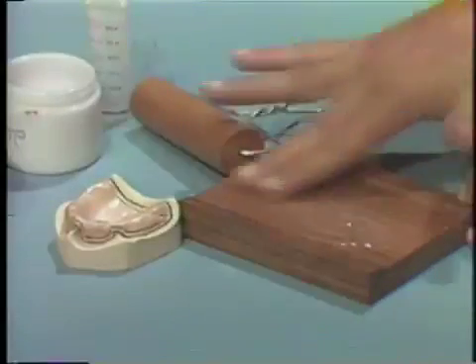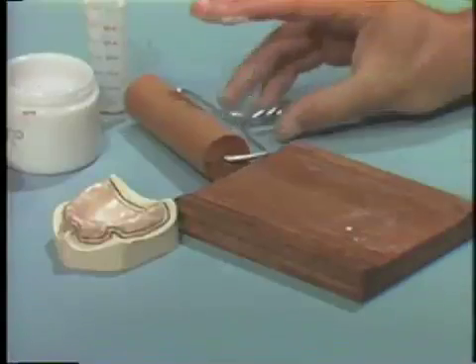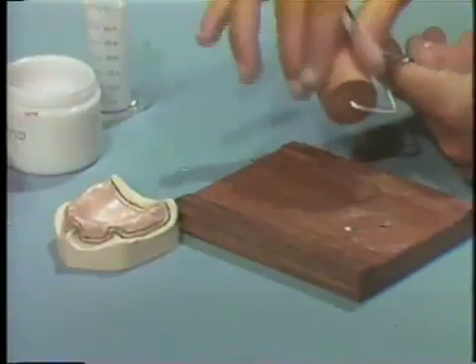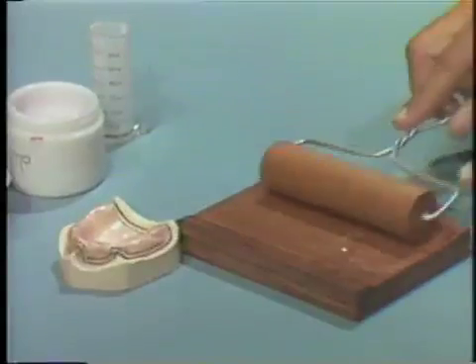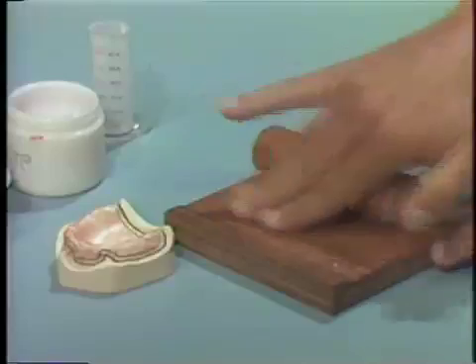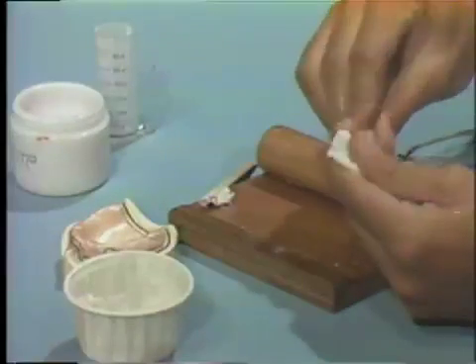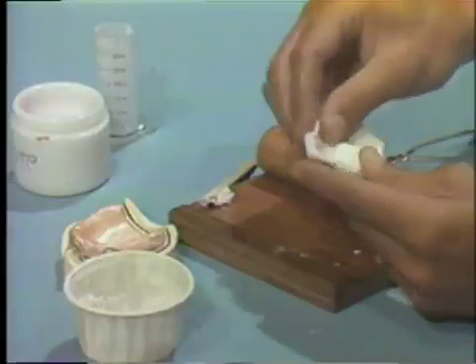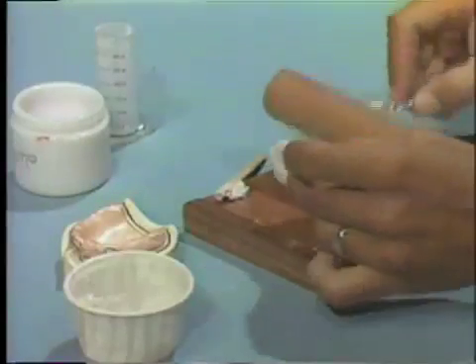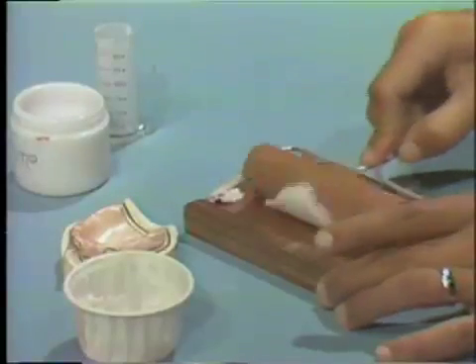Next, lubricate the thick side of the roller board and the roller with petroleum jelly. Also, lubricate your fingers before handling the acrylic resin. When the acrylic resin becomes doughy enough to handle, remove it from the mixing container, knead it, and place it on the thick side of the roller board. Roll it to a thickness of approximately 3 millimeters.